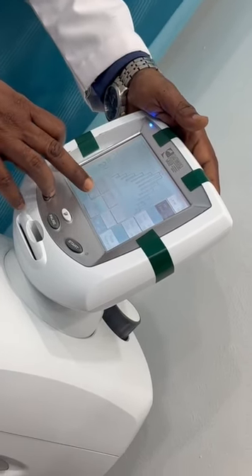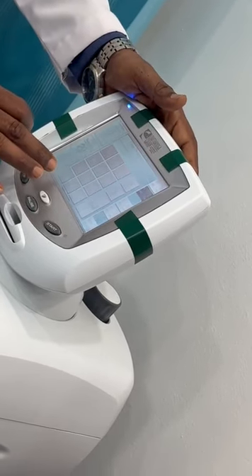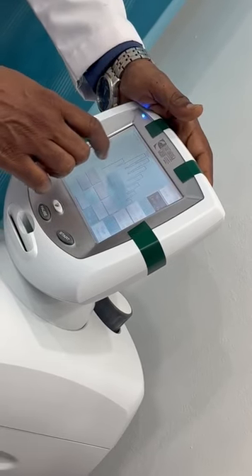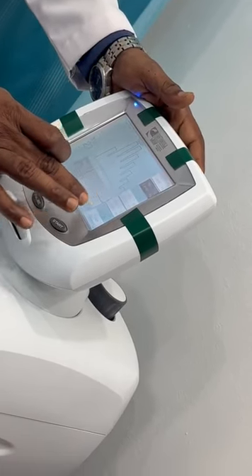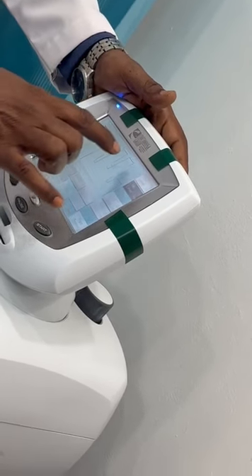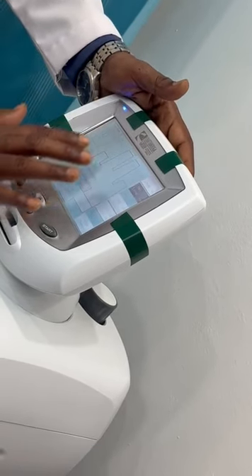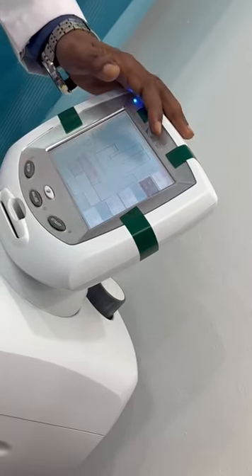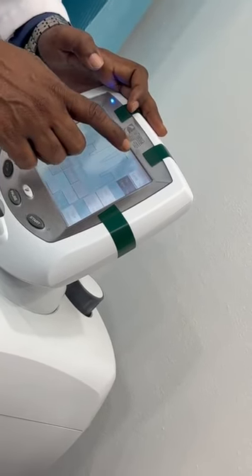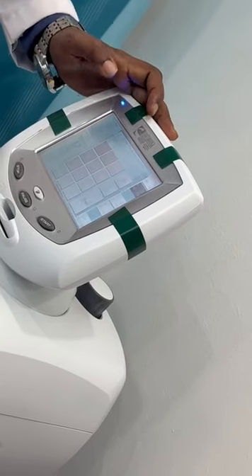Okay, and the steps means how many steps it is having. For example, I give 2 steps. 2 steps means it goes only 2 steps up, and I'll keep 2 steps down here also. So only 2 steps, 1, 2, 1, 2. Based on progression, 2 steps. If you are keeping 8 kg force, then 4 kg will come first, then 8 kg. 8 kg will maintain, then 4 kg, like that. And the steps we can increase.